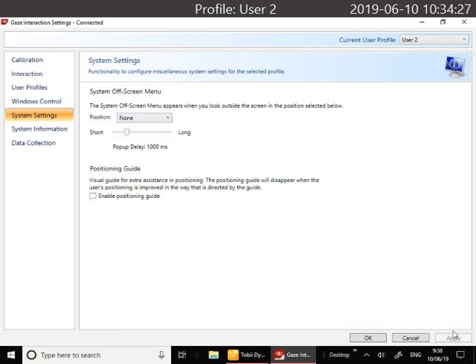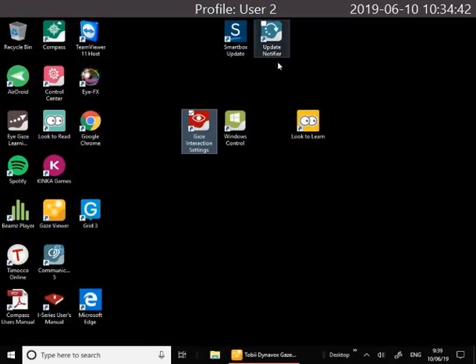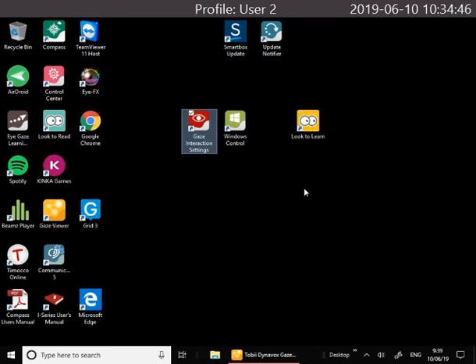When you change settings just make sure you click Apply at the bottom. Down the side here you have some system information about what version you're running. So that's a quick guide to the Gaze Interaction Settings. Once you're ready to go, click OK and get into the software that you're using, which might be Look to Learn, Sensory Eye Effects, or something else.